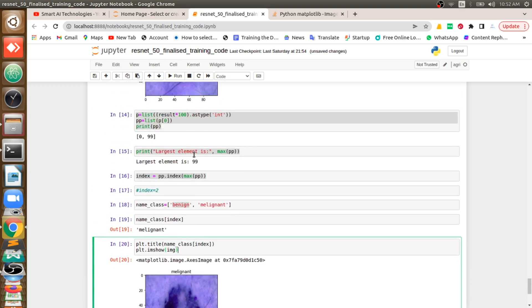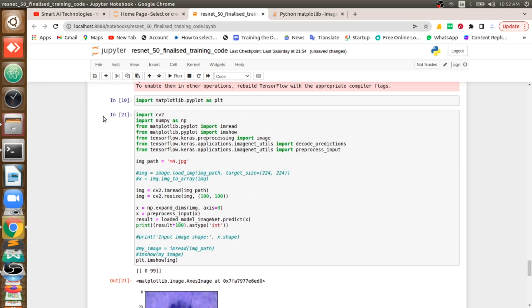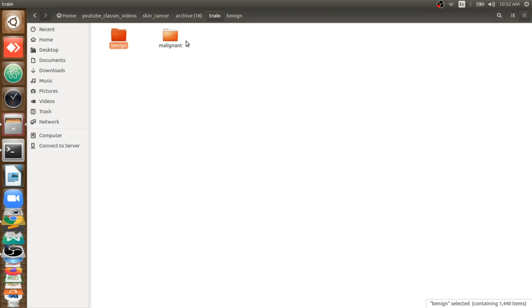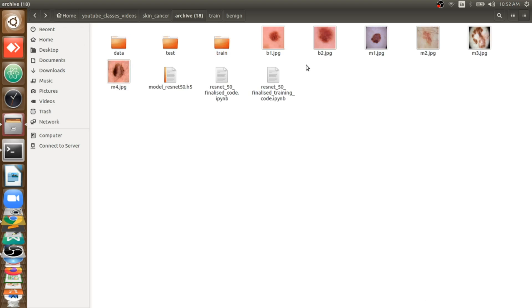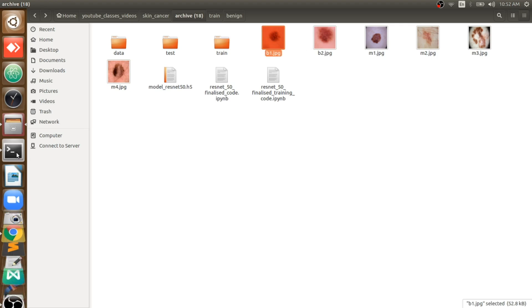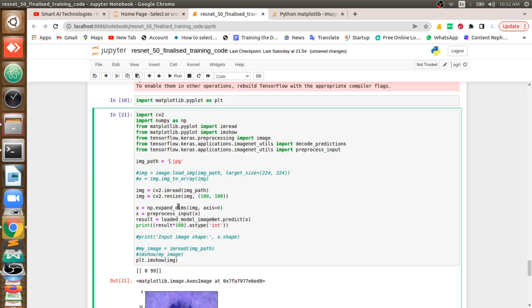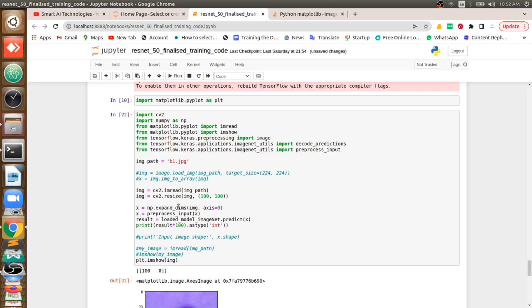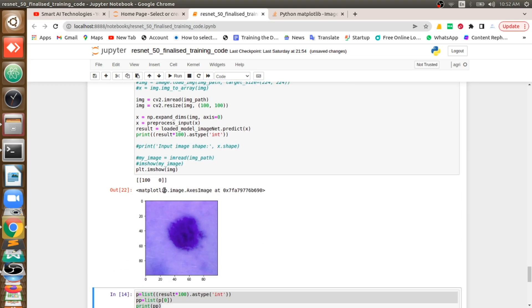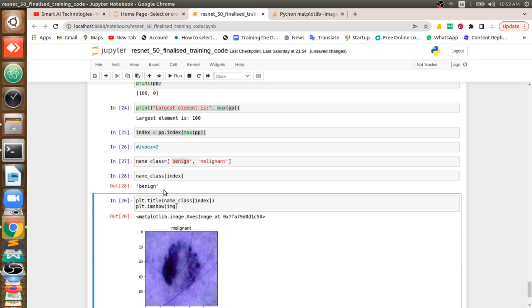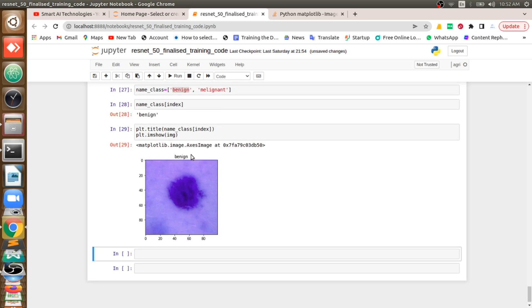We will try a benign one more time. I pasted b1.jpg, which means benign. It says 100 percent it belongs to class 1, so it finally prints that this image belongs to benign. This is the first part of the video.